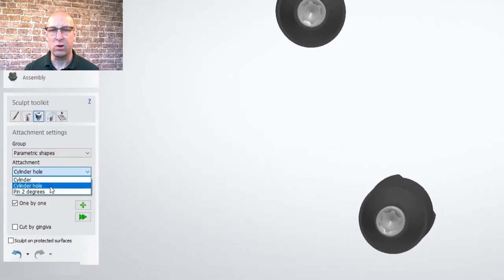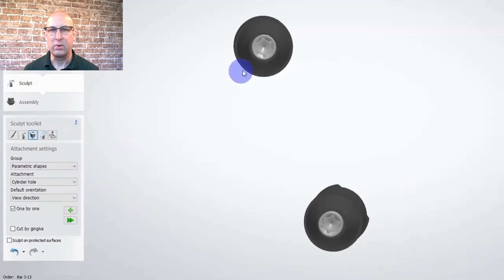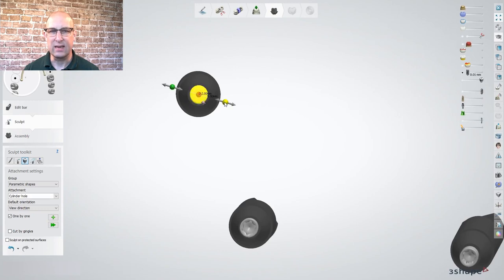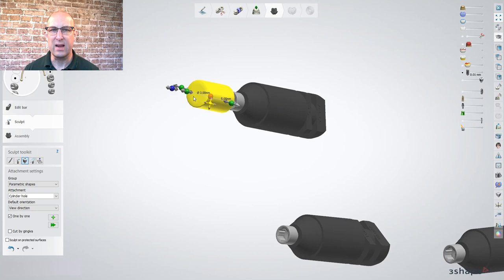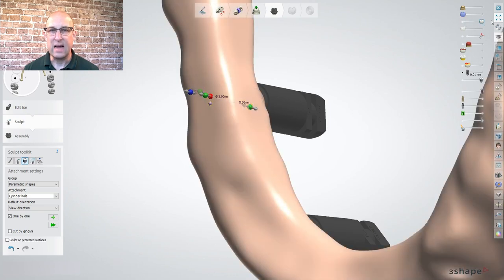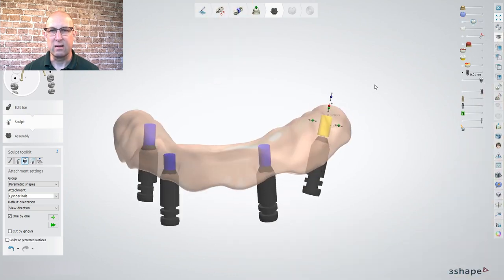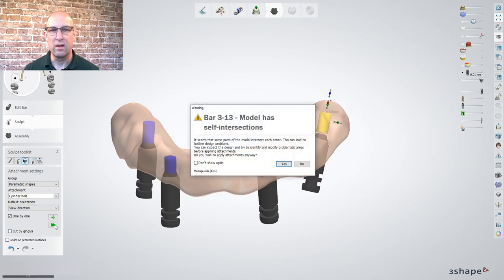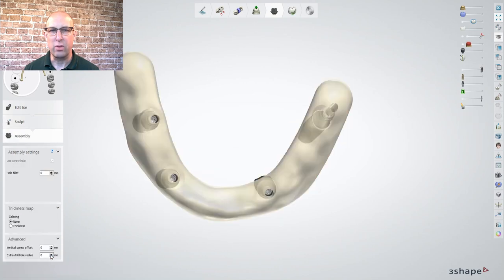Select cylinder hole, view direction. Make only analog and screw visible and position the first side in view direction. Place the attachment in the center of the screw, adjust the diameter manually to 3mm and the height as low as possible so it does not intersect with the occlusal side of the bar. These are our attachment anchors we use later. Do this for all implant sites and press the double arrow — the warning can be ignored. The extra dual hole is getting raised to 3mm.